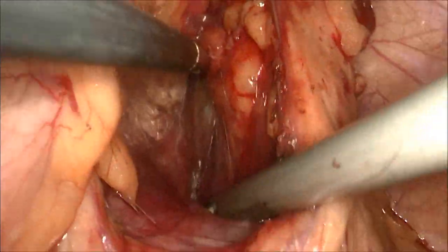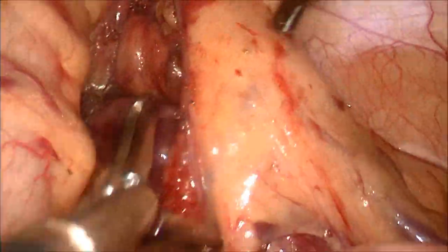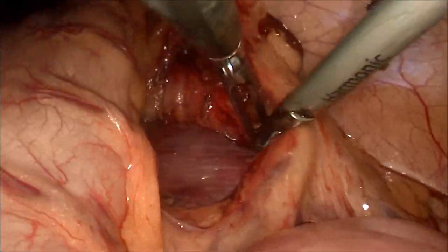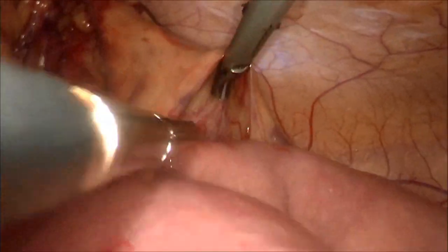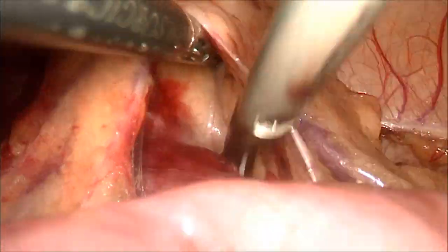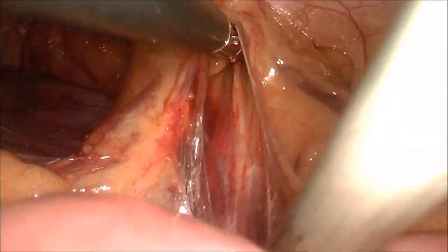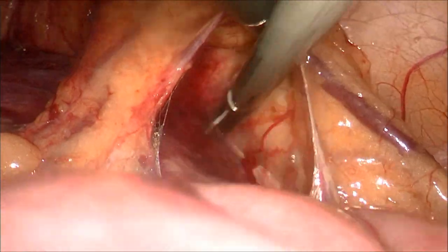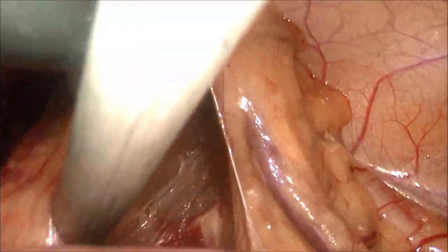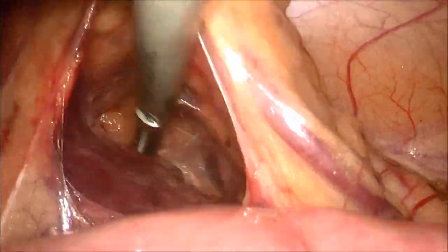As we continue this plane of dissection laterally at the level of the splenic flexure, we see the bluish tinge of the lower polar spleen covered by peritoneum. Likewise, as we progress with the medial to lateral dissection at the level of the descending colon, pushing the retroperitoneal fascia down, we join this plane to the lateral peritoneum that has already been incised.